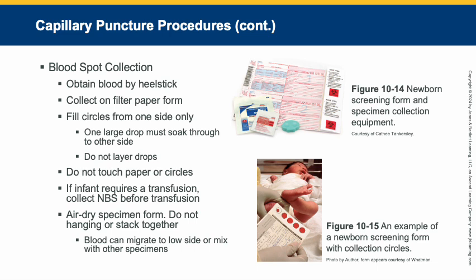After collection, the specimen must be allowed to air dry in an elevated horizontal position away from heat or sunlight. Specimens must not be hung to dry or stacked together before, during, or after the drying process. Hanging may cause the blood to migrate and concentrate toward the low end of the filter paper and lead to erroneous test results on the sample. Stacking can result in cross-contamination.